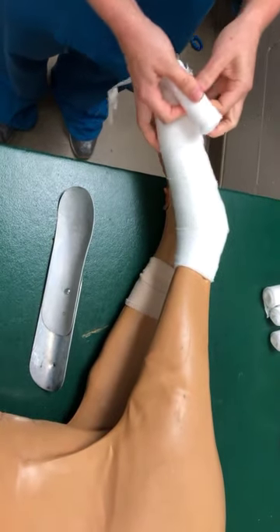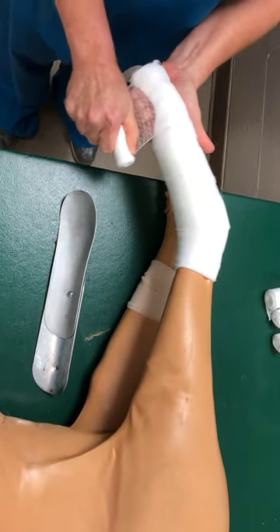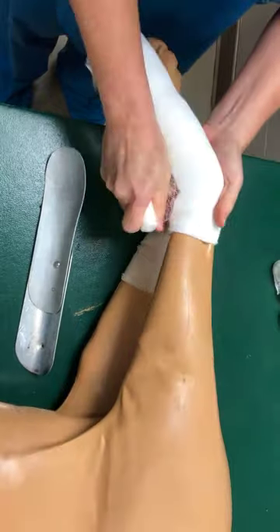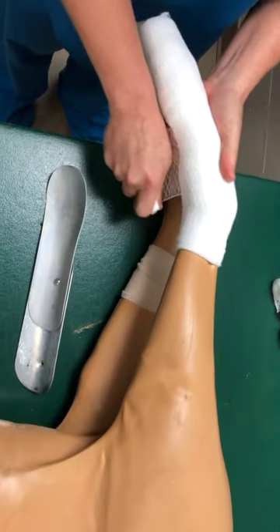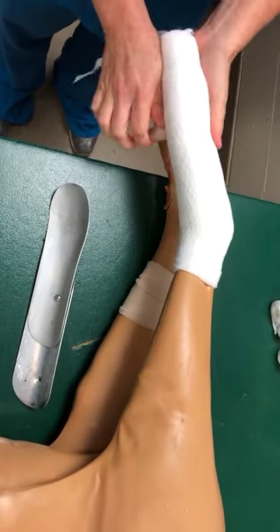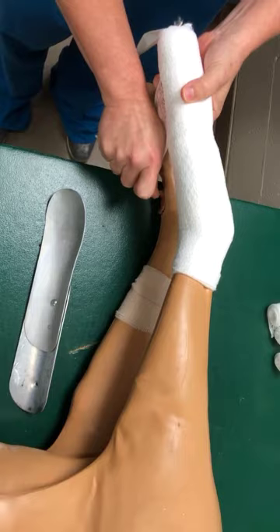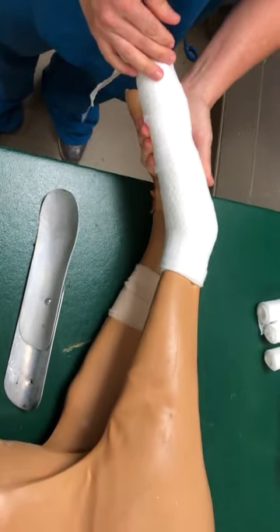Then we will get our stretch gauze. This goes on nice and snug. If you don't compress, it's going to be a little difficult for your bandage to stay in place, so we do need to have a bit of tension here — not as much as a true Robert Jones, but it does need to be snug. We'll snug down our padding first. Make sure that there is even compression for the entire length of the bandage.